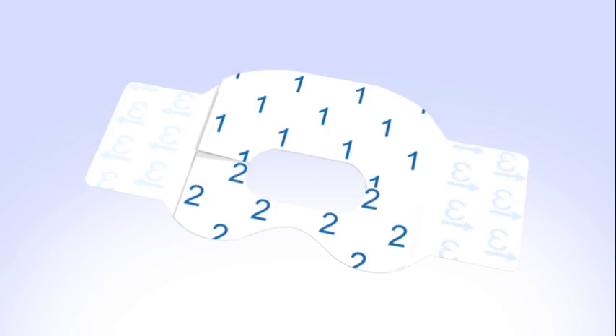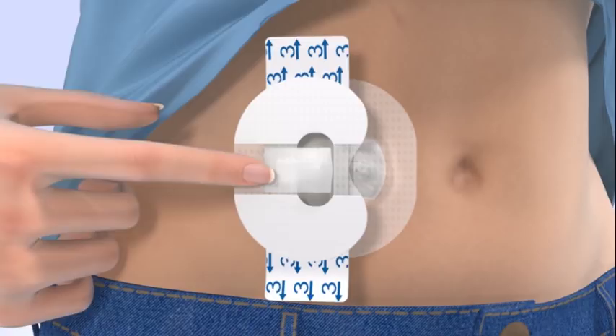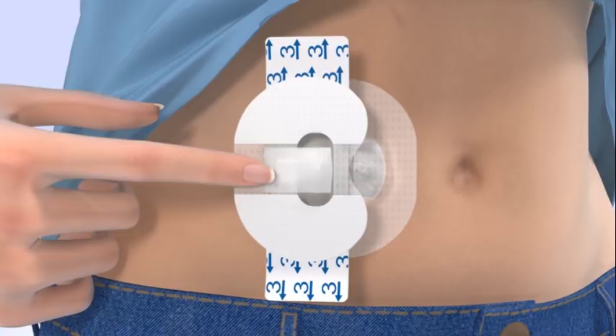To apply the second tape, remove the paper backings marked with the number 1 and 2. Rotate the tape and place it over the transmitter. The rounded part of the tape should cover both your skin and the top part of the transmitter. Smooth down the tape and remove the two paper tabs marked with the number 3 from the sides of the tape. Smooth the tape against the skin.